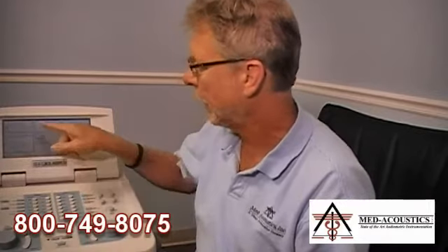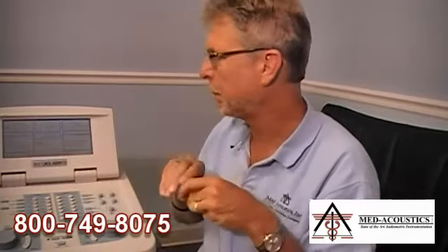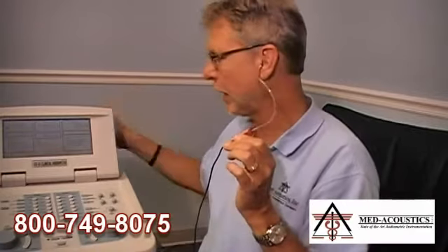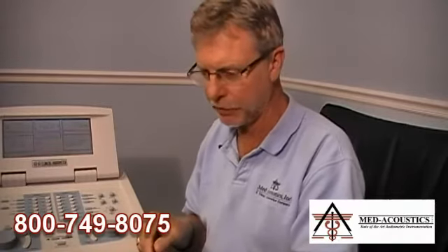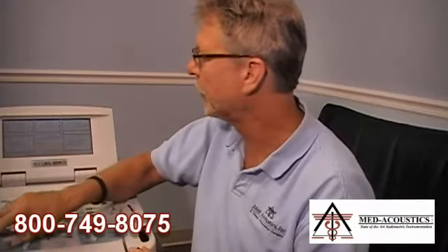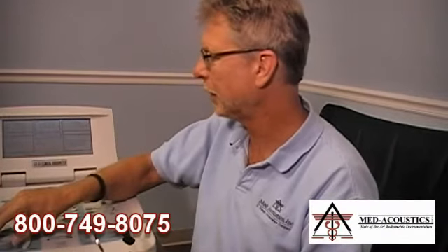Next I check the insert earphones. I put a tip on the insert and switch the audiometer from phone to insert. I have a pure tone going through the right insert at 70 dB, so I place it in my ear and do the same thing — I listen to make sure it sounds like 70 and not 20, I stress the small cord to confirm a consistent signal without crackling, and I turn the plug where it's plugged in to check for static or variance. Then I do the same for the left insert.